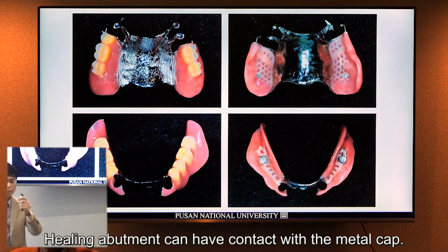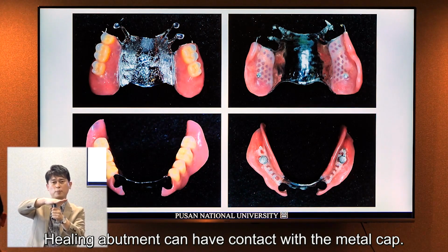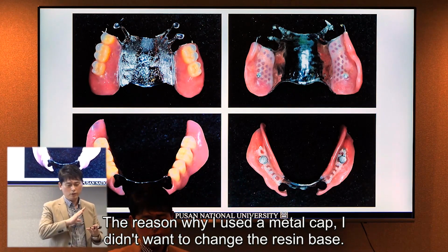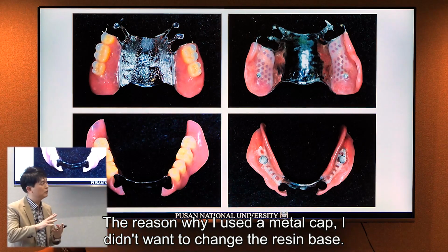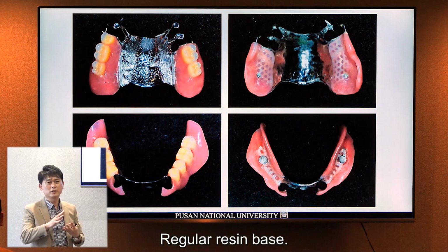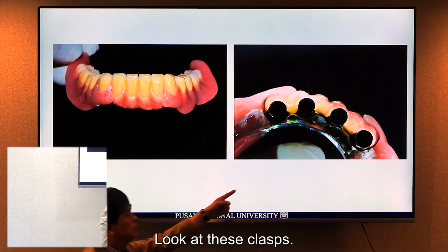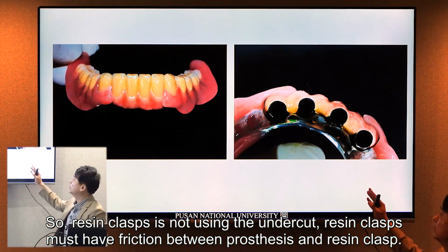So the healing abutment can contact the metal cap. The reason I use the metal cap is that I wanted not to change the regular resin base. Look at this clasp. The resin clasp is not using the undercut.